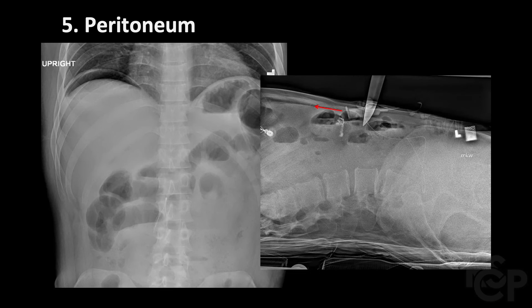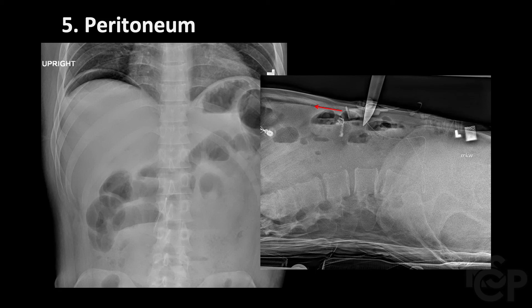The fifth thing we want to assess is the peritoneum. Look for any abnormal densities, which could indicate ascites, or any abnormal lucencies, which could indicate pneumoperitoneum. On the left, you can see an upright x-ray with the classic appearance of pneumoperitoneum — free air underneath the right hemidiaphragm. Upright x-ray has a much higher sensitivity for free air than supine imaging. If patients can't tolerate upright imaging, decubitus or cross-table imaging can be used instead. Free air is best seen against a smooth surface like the liver, so for a decubitus view it is better to have the patient on the right side up. The right image is a cross-table lateral view of the abdomen in a patient who was stabbed with a knife; the red arrow indicates pneumoperitoneum just deep to the anterior abdominal wall.